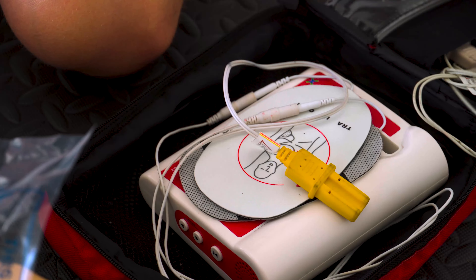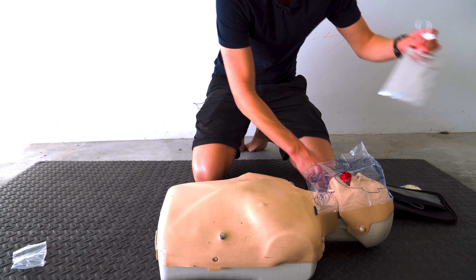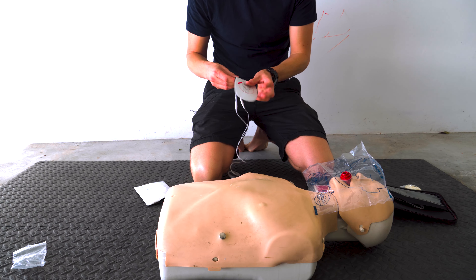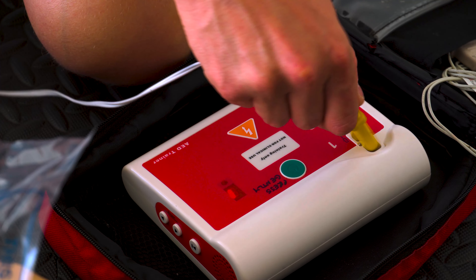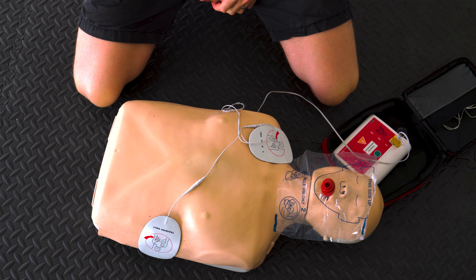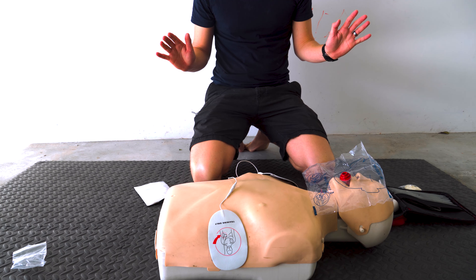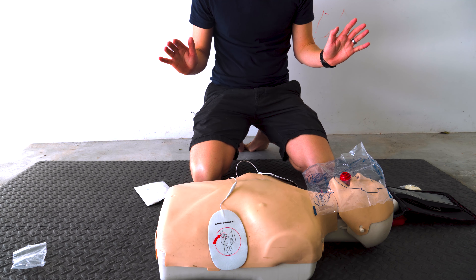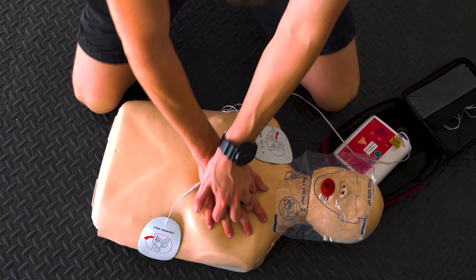The AED arrives — turn it on. AED prompt: 'Remove pads from package and apply to patient's bare chest.' Pad applied. AED: 'Do not touch the patient, analysing heart rhythm. Shock advised, charging.' Clear the patient. AED: 'Stay clear of the patient, deliver shock now — press the orange button.' Shock delivered. 'It is safe to touch the patient.'